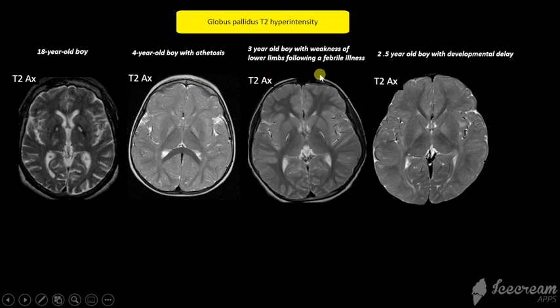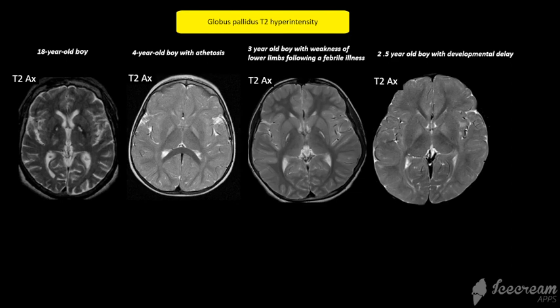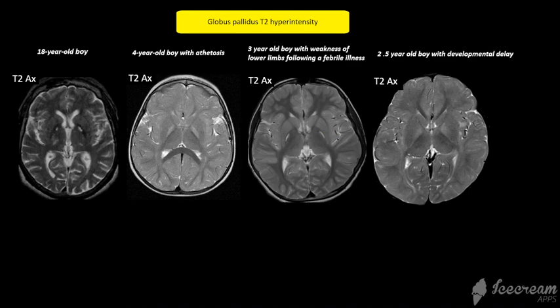The history in this child is very suggestive of a metabolic etiology, in that acute metabolic decompensation has occurred with a febrile illness, and the symmetric, almost cystic cavity changes are very typical for methylmalonic acidemia.